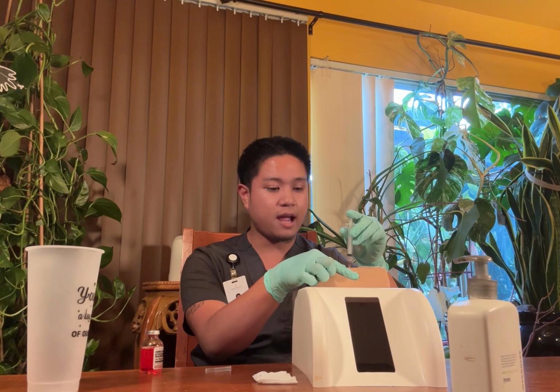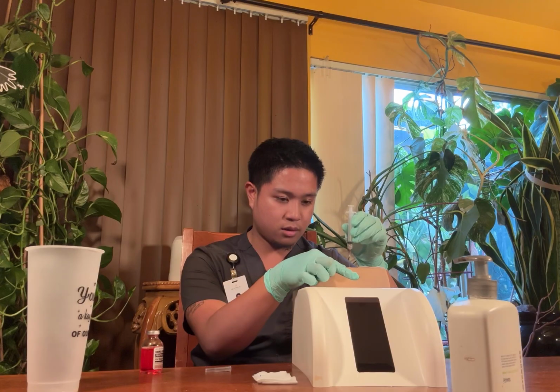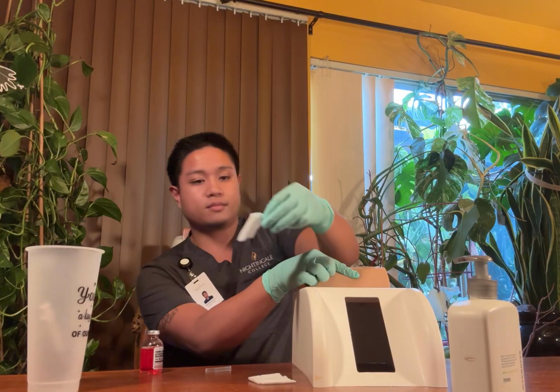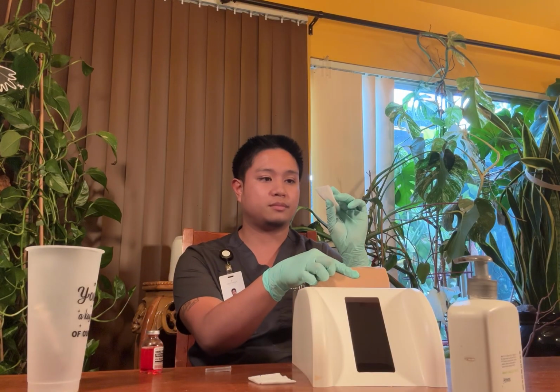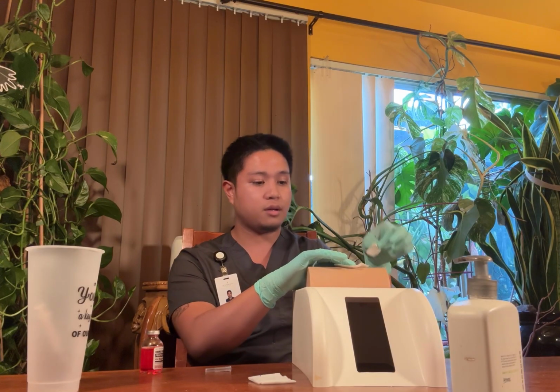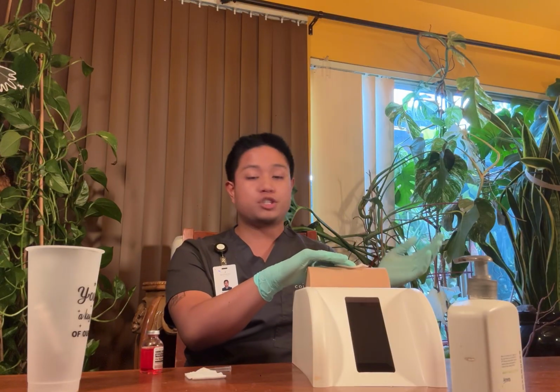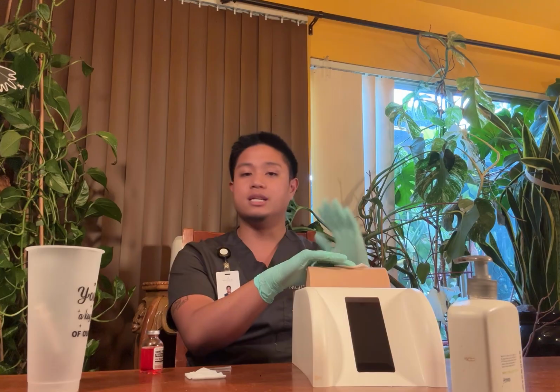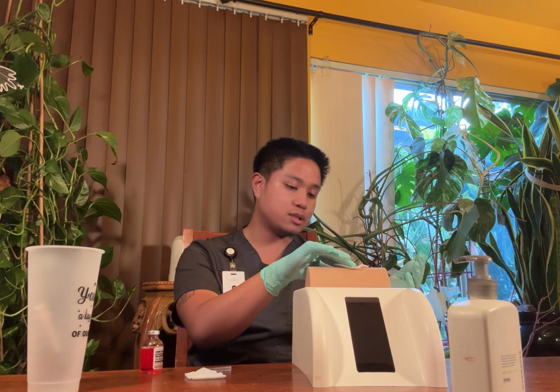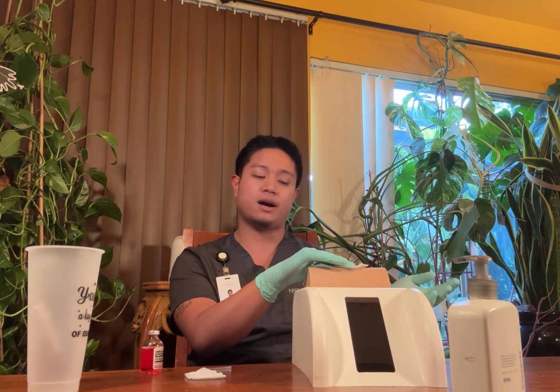Okay, I'm now going to remove the needle slowly, and then I'm going to dispose of it in the designated sharps receptacle, and then I'm going to grab a clean gauze and place it right on top of the area and add some slight pressure. I will make sure not to massage the site, and I will double check that there's no bleeding or anything out of the ordinary. Right now there doesn't seem to be any bleeding present, so we will not need to put a band-aid. The site looks fine so far.